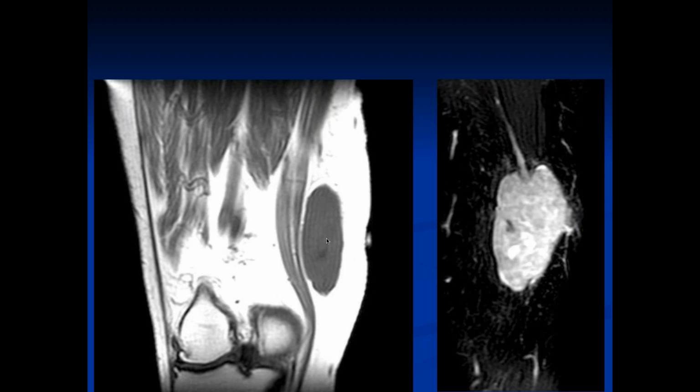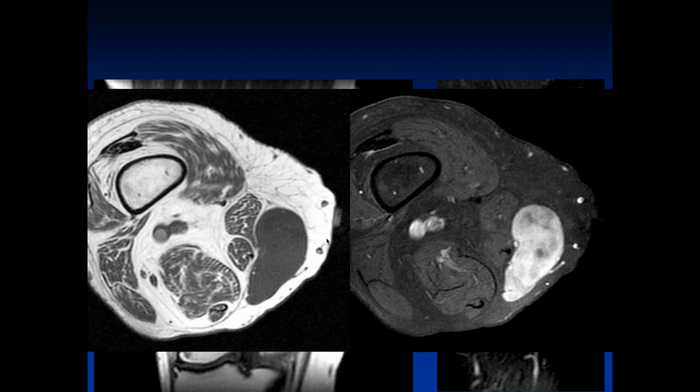We're on smooth muscle lesions. Could just have kind of a luminal thing. Yeah, okay, so pretty similar characteristics here on the axials. It's well circumscribed, but it's got this heterogeneous enhancement, and internal, yeah, just a leiomyoma, like I thought. It turned out to be a leiomyoma, presumably of the vessel walls or one of the vessels there. Sure. It's a large benign lesion.